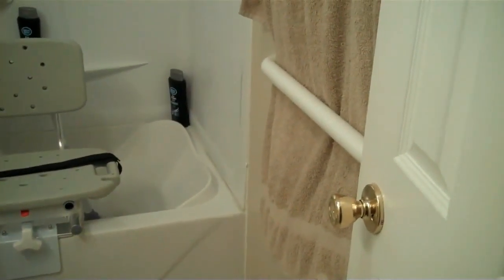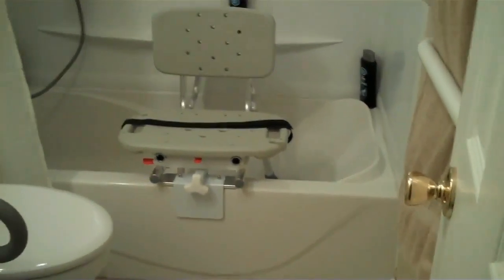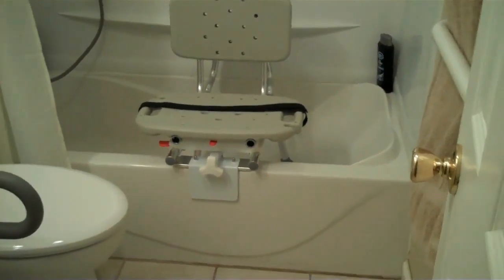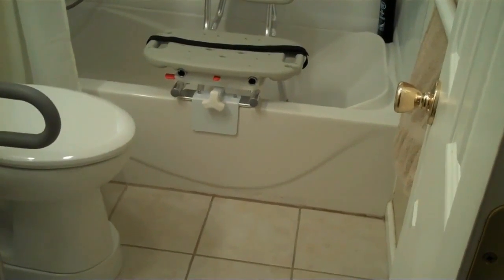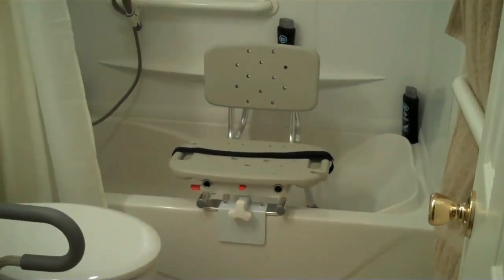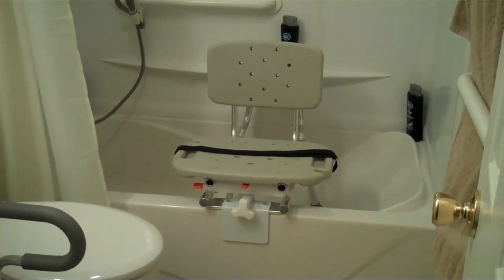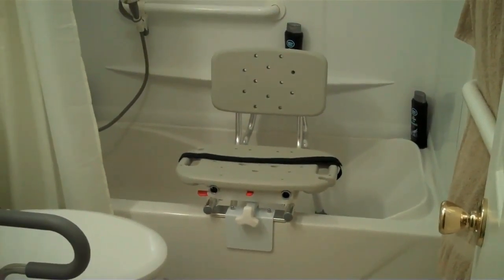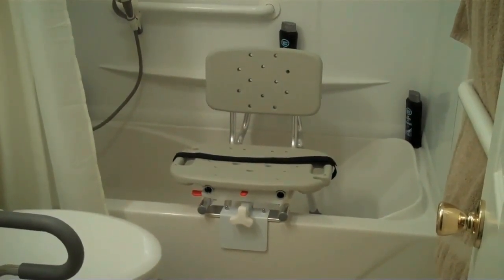We put in a sliding tub transfer bench that clamps on the side so that we didn't take up any of the room between the toilet and the wall. How is that working for you? It's working out well — it's easier for me to get into the shower more safely, and being able to sit down and wash myself is much easier.